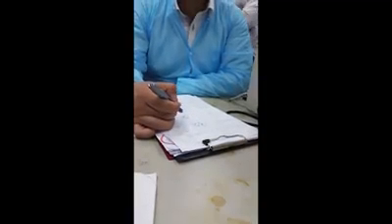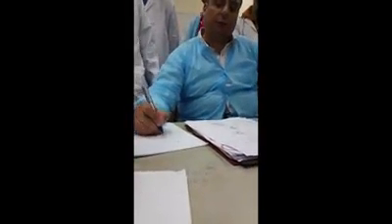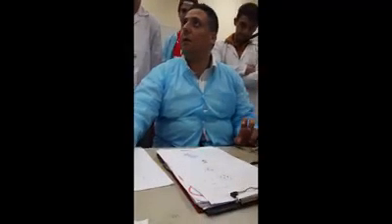Here, because we use the right stain, what we call Wright stain. This one we didn't pronounce. Wright stain is the stain which we use to stain the white blood cell.